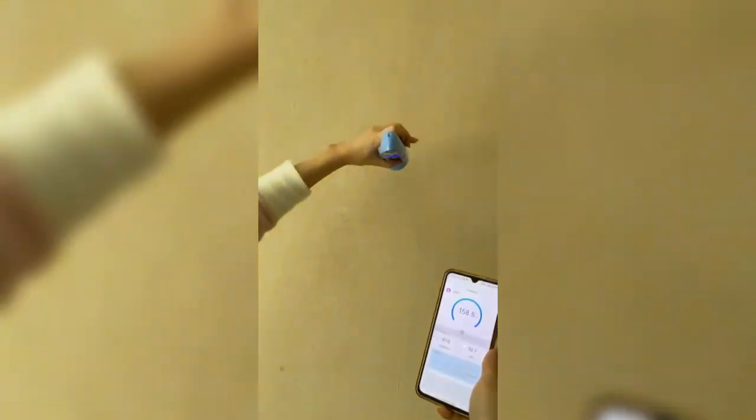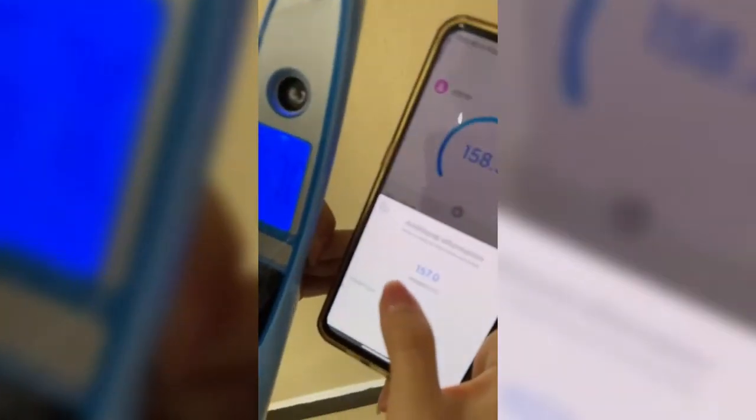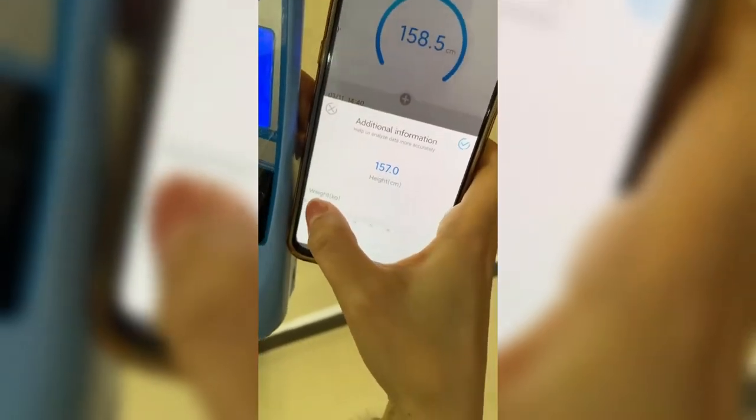Okay, and we can start the measurement. It will show the same result — 157cm — on the app and also on the display screen, as you can see here.